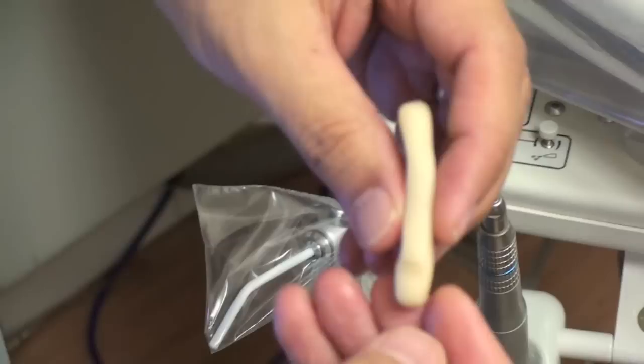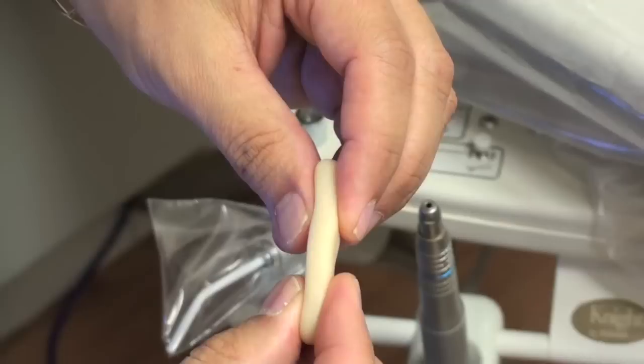You could always redo it, but if you hurt the patient, then we've really scored a negative. So I'm looking at this — not feeling any heat generating here yet. If I put my fingernail in, I see it print but it doesn't really bounce back fully, so this would still distort big time. I'm going to wait a little longer.